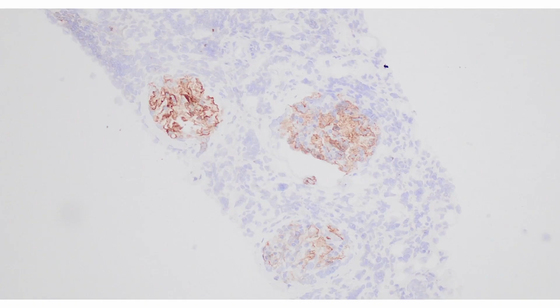So we did order PLA2R, which was positive along the capillary loops. So this proved that this was a primary membranous nephropathy. We also ordered exostosin 2, which was negative. And because we had the tubular basement membrane staining, we ordered LRP2, which was negative as well.